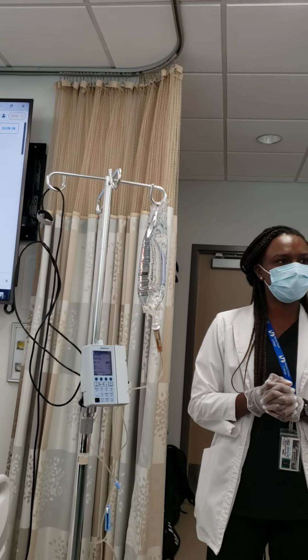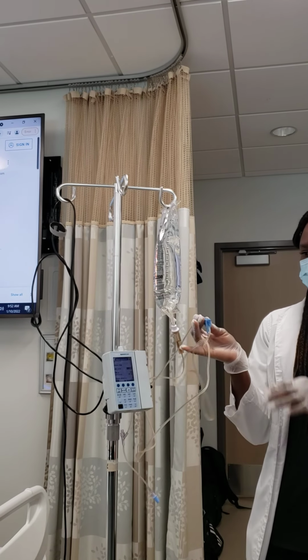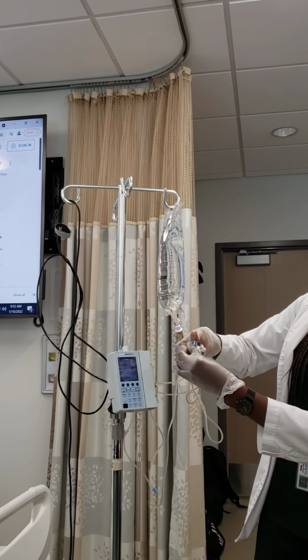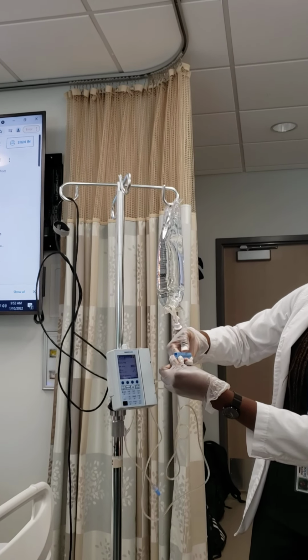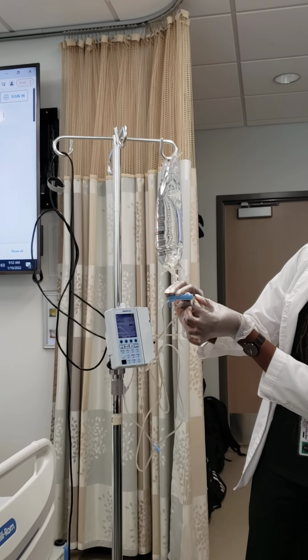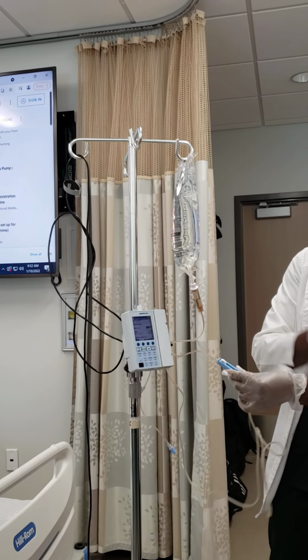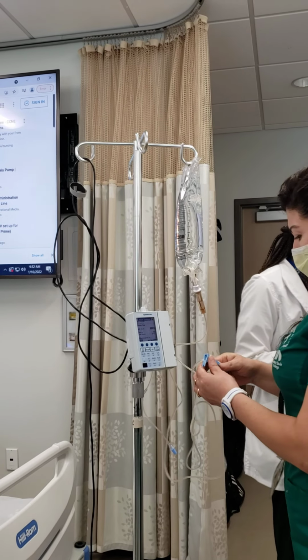Sorry for this question. Now it's on or off, the clamp? It's locked. You see? When it's farthest away, it's open. When it's towards the smallest section, it clamps it. You can see it through here how it clamps. You want to try it? I think if you feel it, then you'll understand how it works.